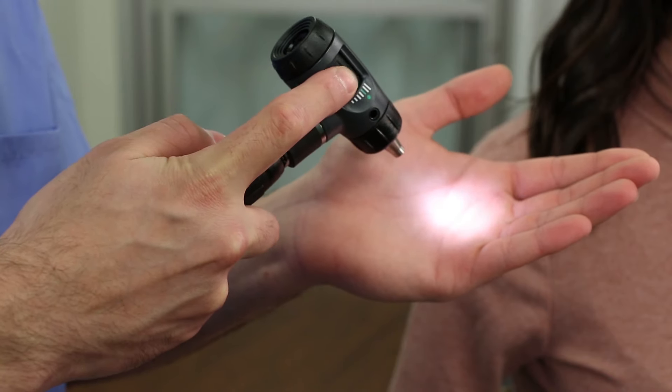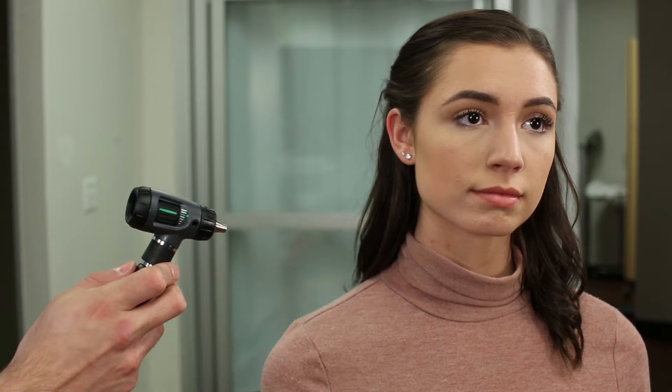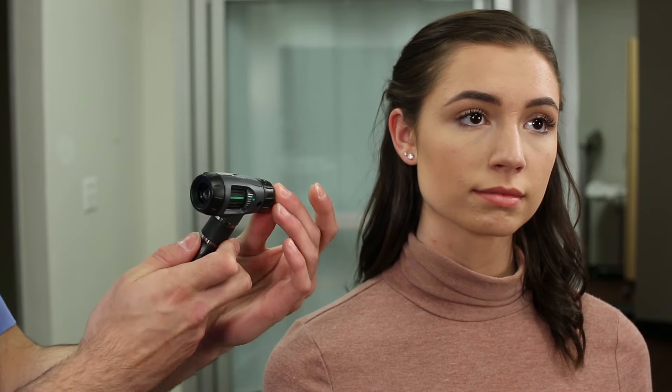With any ear exam, you'll want the patient to sit down and slightly tilt their head away from you to obtain easier access to their ear. Turn the scope on at full intensity. Align the green marks on the focus wheel to ensure you're operating at the default position.